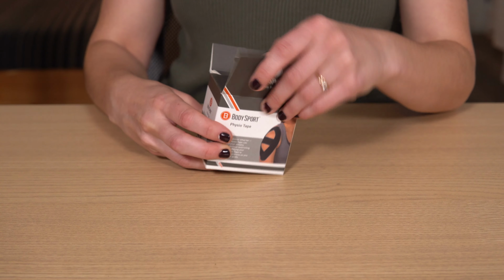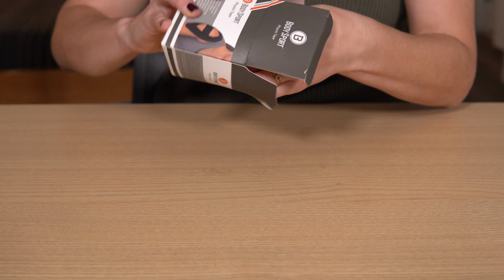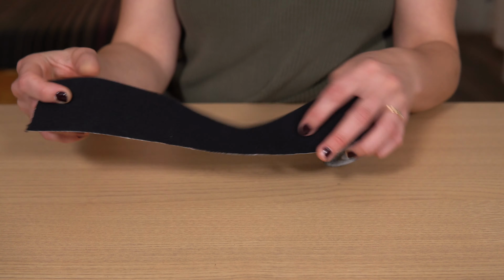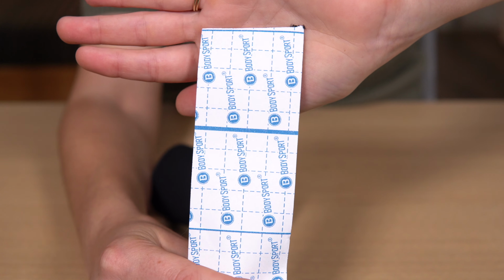So we are going to open up our Kinesio tape, and I would suggest getting somebody to help you with this. I had a really tricky time doing this on myself, as you'll probably see throughout this video that it was a little difficult for me. So have somebody help you if you can.